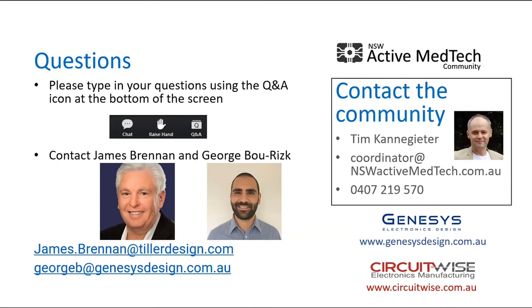A rational common sense approach is that 100% failure consideration only makes sense in the context of assessing the device class. So if any software failure can cause a dangerous situation to occur, you use that 100% probability of failure to determine which class the software is. To put things in perspective, I say Class A is why bother. Class B is sensible and aligns with good engineering software design practice, as Deanna will well know.